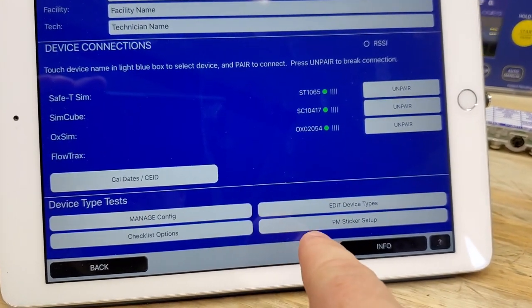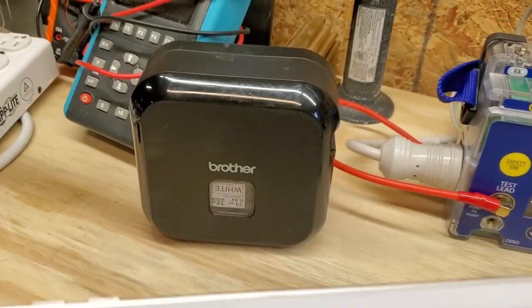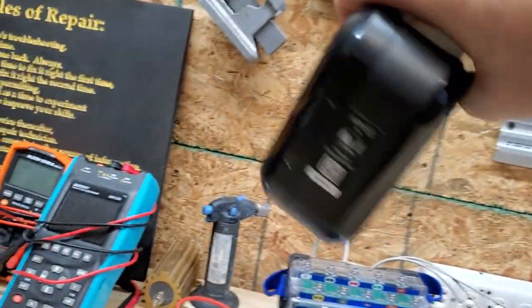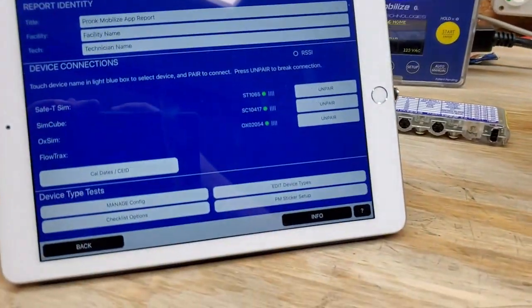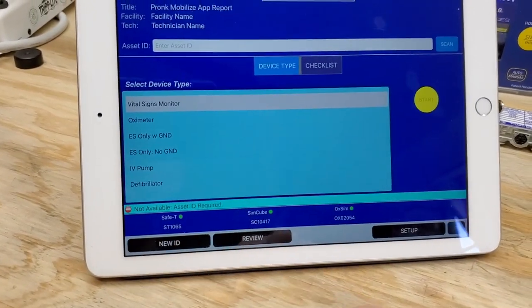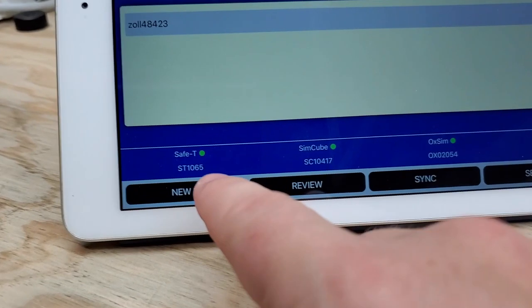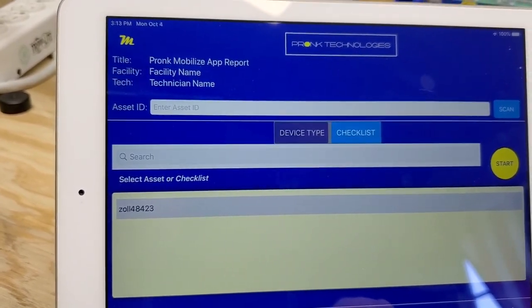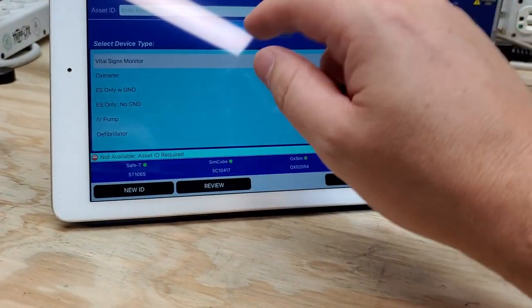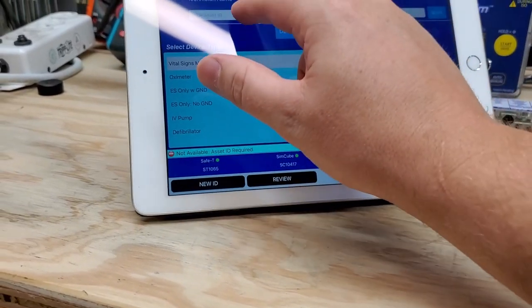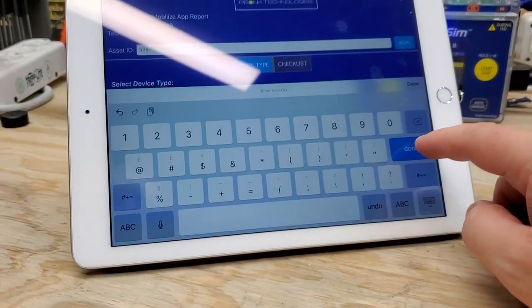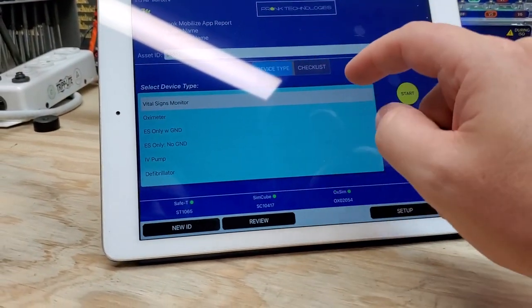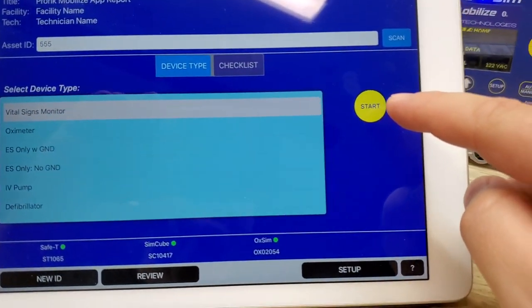You can see we have PM sticker. See this little guy right here? This little brother printer. That little printer right there will print your PM stickers in the field. It's battery powered. So I have a battery powered label printer. I can print my own PM stickers and you set that up here inside your settings. We're paired. You can see down at the bottom showing the status for all the devices that are currently attached for that selected test.